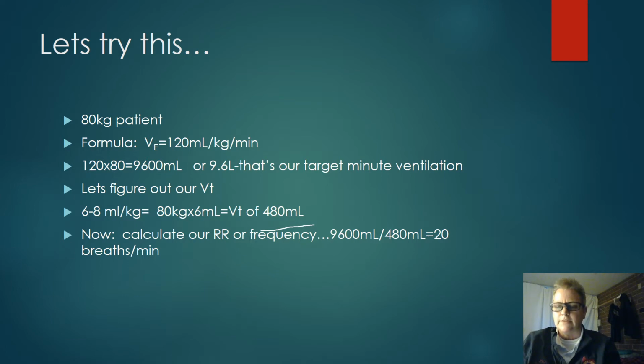Remember our old vents? We used to have those cards that had our minute ventilation, and our tidal volumes and respiratory rates were based off that minute ventilation, and I thought that was just silly. Why not just set a tidal volume and a respiratory rate and on you go? Well, it's all about minute ventilation, and I understand how ignorant I was and how ridiculous I thought using those cards was. It's all about getting the ventilation to the alveoli and helping that oxygenation. So I feel silly that I was so ignorant.